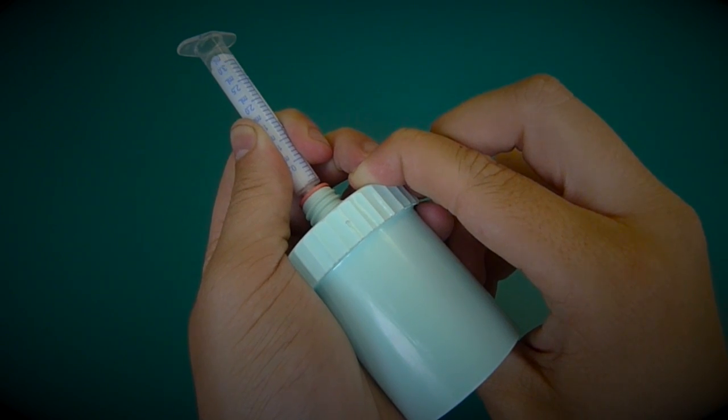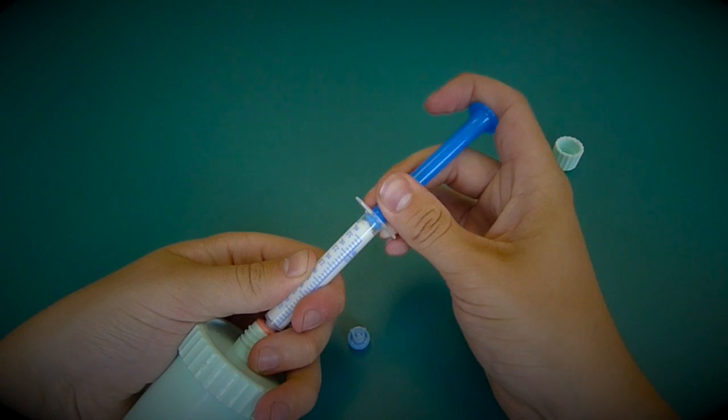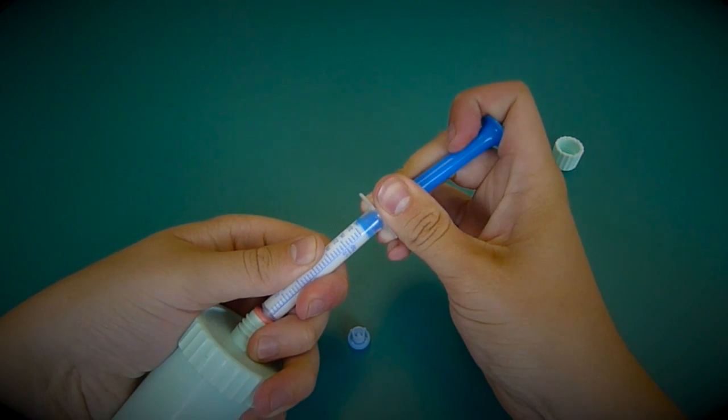Fill all the way to the line and then take your plunger and at an angle slowly wiggle it into place at the 3 mL line.